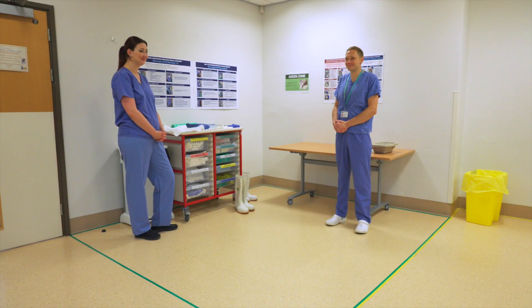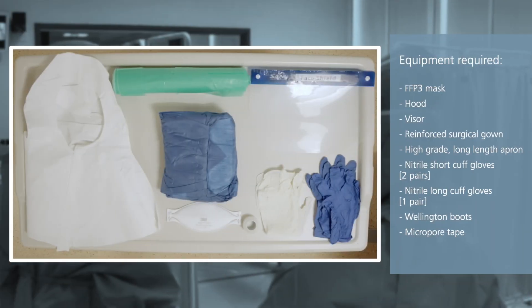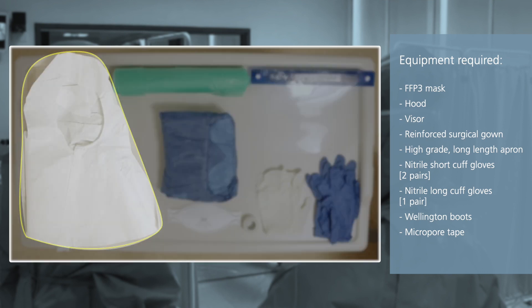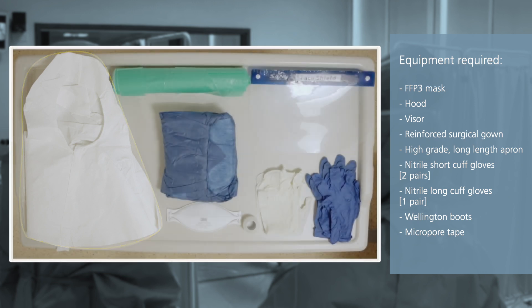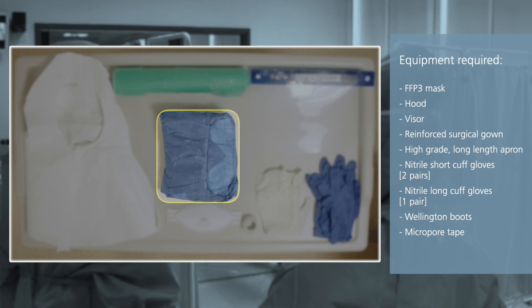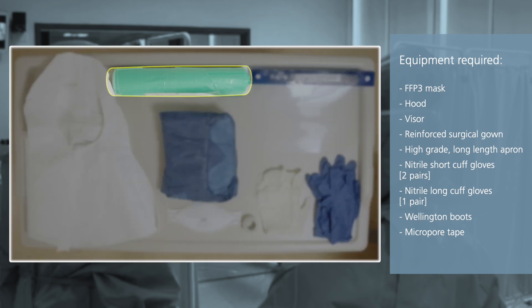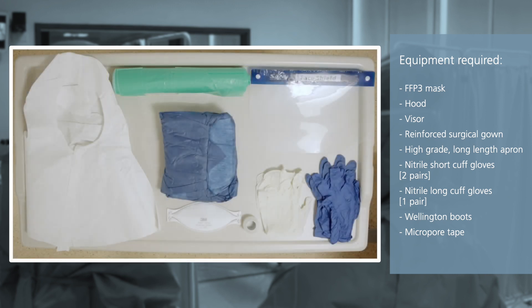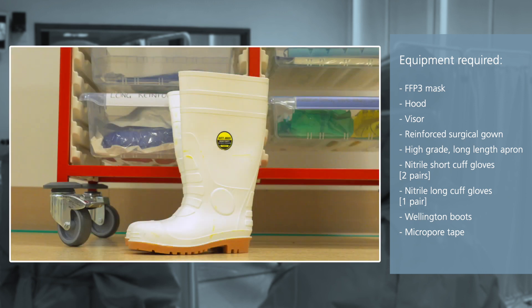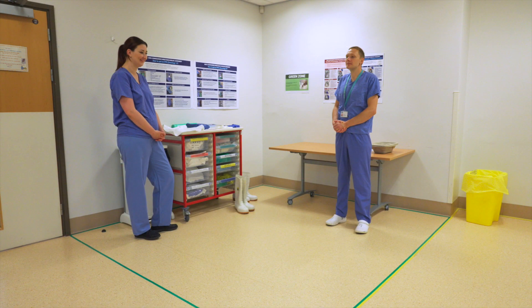The HCID Assessment PPE ensemble includes an FFP3 mask, a front opening hood, a full face visor, a reinforced surgical gown, a high grade apron, three pairs of gloves, and Wellington boots. All are worn over a set of surgical scrubs.